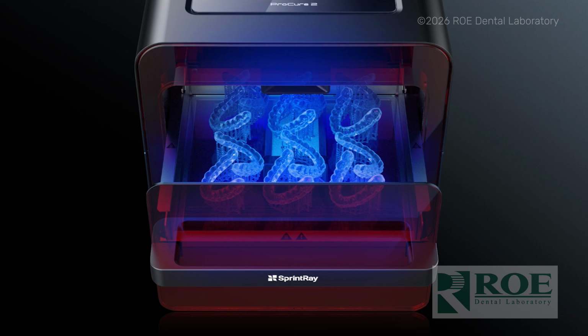And then it's got to go into the correct cure box. If you're using denture tooth resin, you need to use a cure box that can properly post-process and cure these resins, because these are going to be in patients' mouths sometimes for many, many months, sometimes even permanently. So you want to have a biocompatible material, and the final step is truly curing that resin.